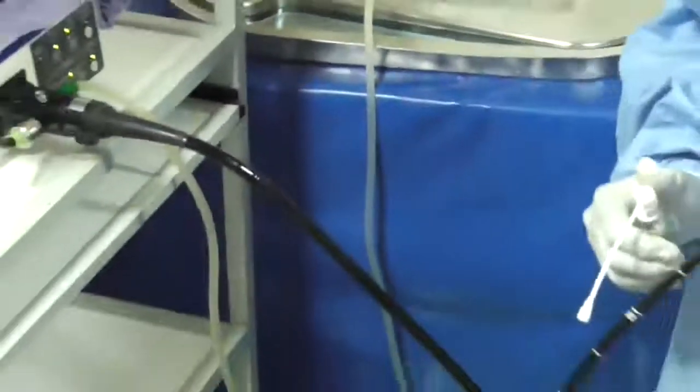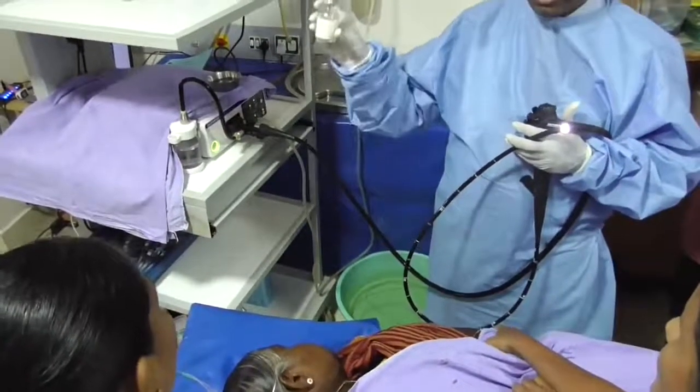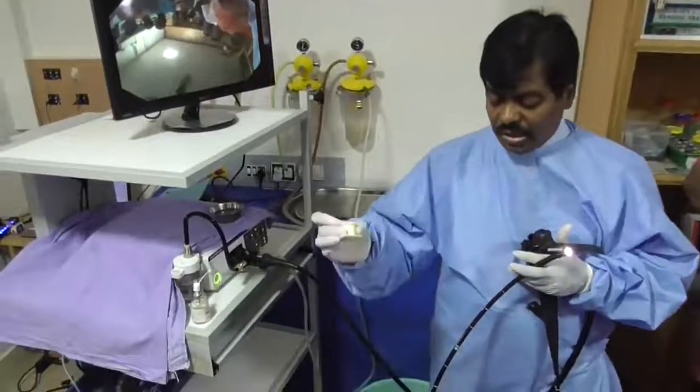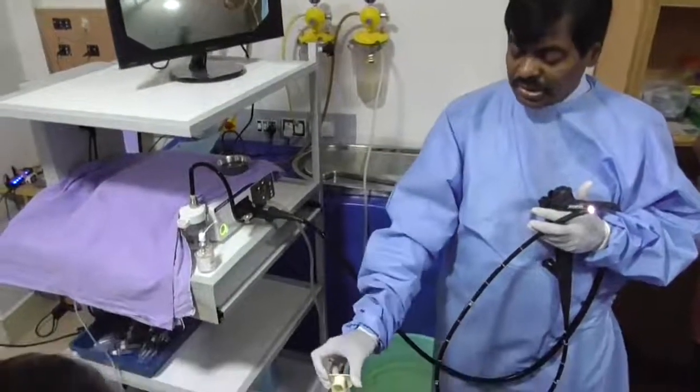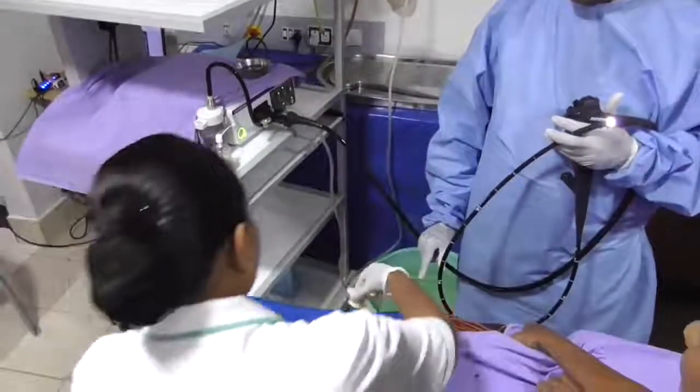Once satisfied the instrument is working, explain the procedure to the patient, check there are no dentures, confirm the patient has fasted, then spray with either xylocaine or sedate the patient. Then place a mouth guard to protect the teeth. See how my assistant is holding the patient.